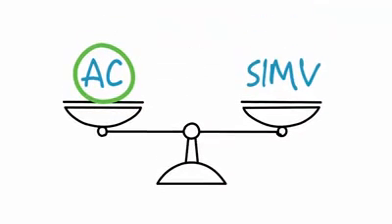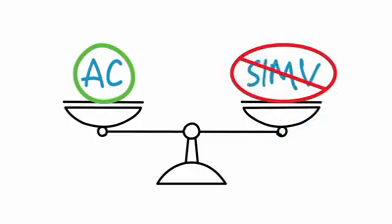So yes, the ventilator will allow full spontaneous breathing during the SIMV mode, which in theory seems like a good choice because it gives the patient freedom to determine their own volume. But this may not be such a good idea when initially placing a patient with respiratory impairment on a mechanical ventilator. In other words, even though they're free to take larger or smaller breaths, their respiratory muscles may be so weak initially that all they can do is to take smaller breaths, which would not be beneficial for our patients.